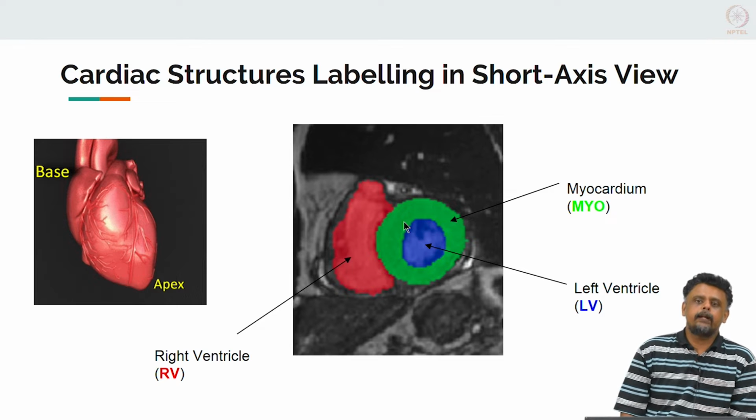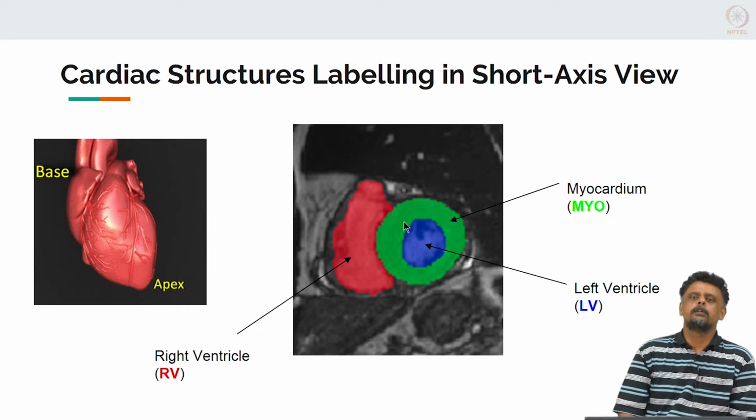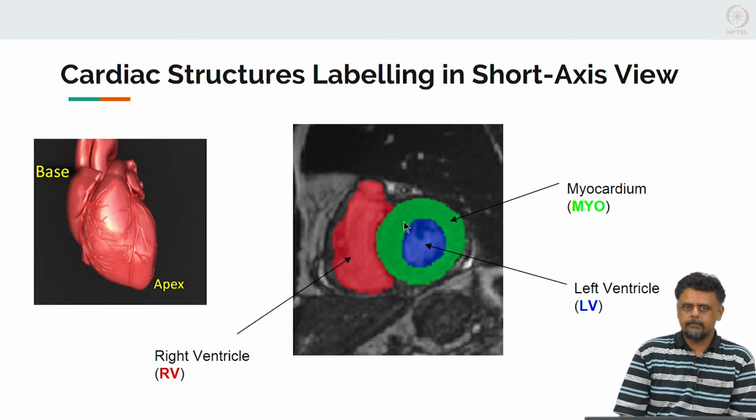The idea is to predict disease. So a patient walks in, maybe being referred by some cardiac specialist, who says maybe you should have your heart scanned by MRI. So he does the scan and the volume image comes out. Then maybe it is nice if you have a system that provides a diagnosis on its own.